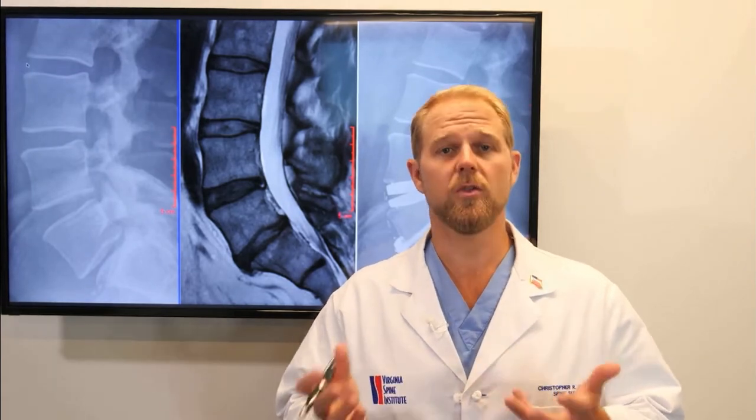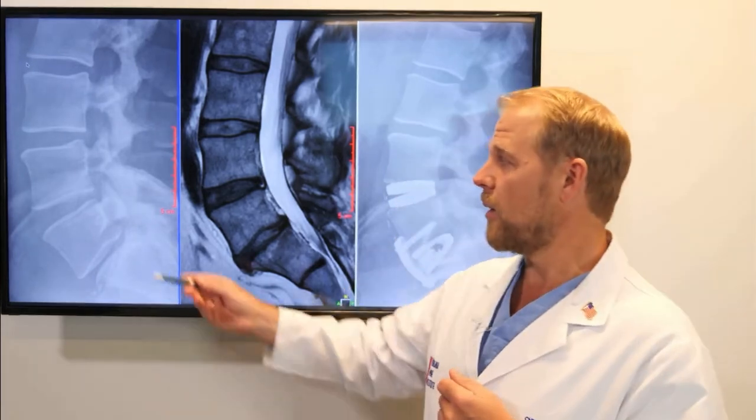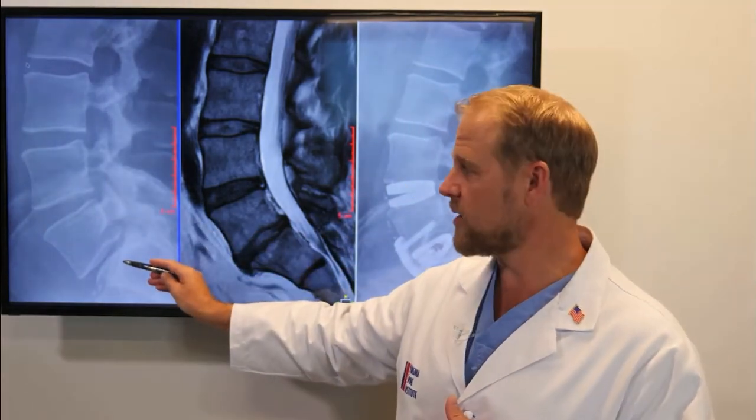There are times when a spine problem degenerates beyond the point where a disc replacement is a good option — it's just too far gone. And so in those situations, a fusion is sometimes the best option. In this example, we're going to start looking at a lateral x-ray of the low back, the lumbar spine.